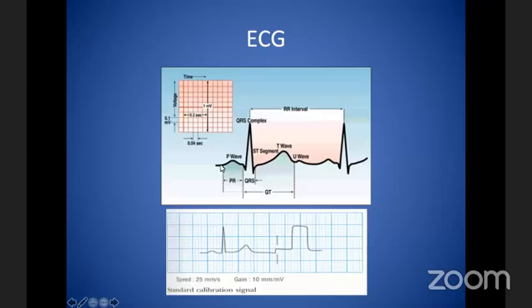You all need to understand there's a P wave, which is atrial contraction, followed by a QRS, and then an ST segment turning into a T wave. So P, QRS, ST, and T. I'm sure you all know this, but remember the paper speed should be 25 millimeters per second. That's the speed across this axis, and the voltage will be 10 millimeters per millivolt, which means these two squares is 10 millimeters is 1 millivolt.